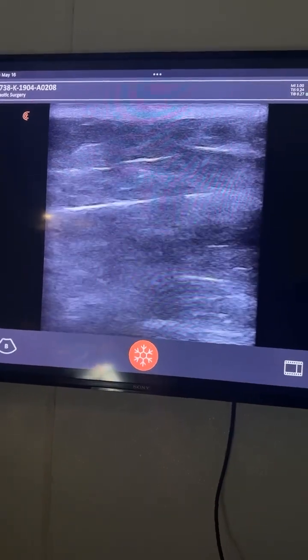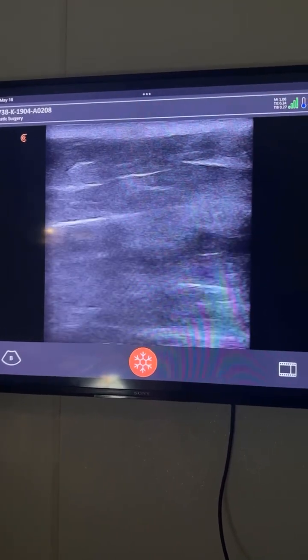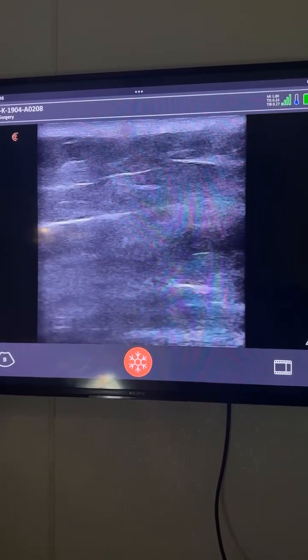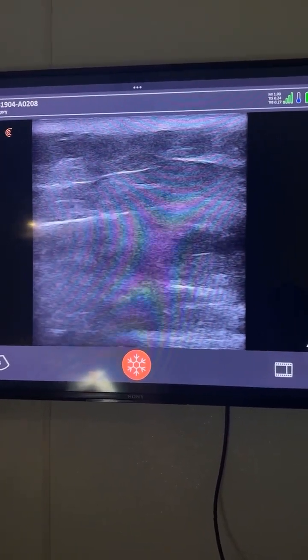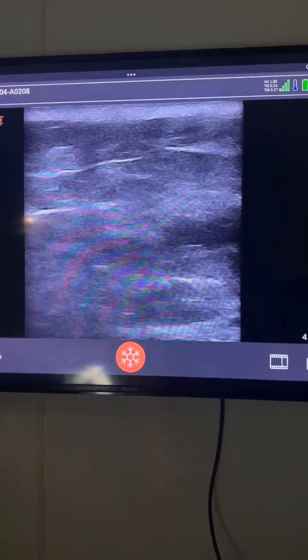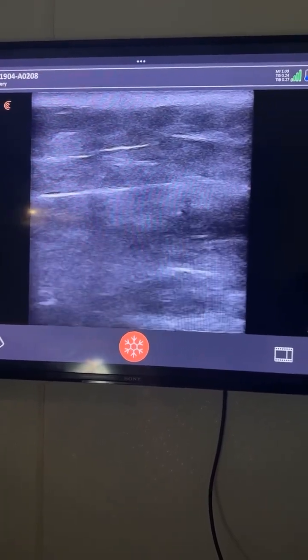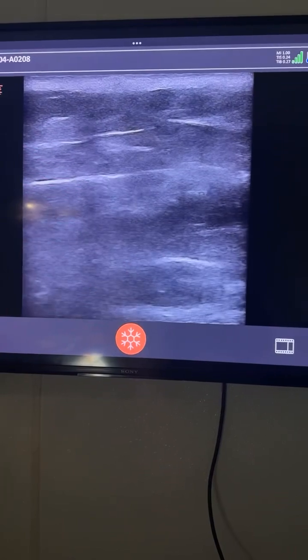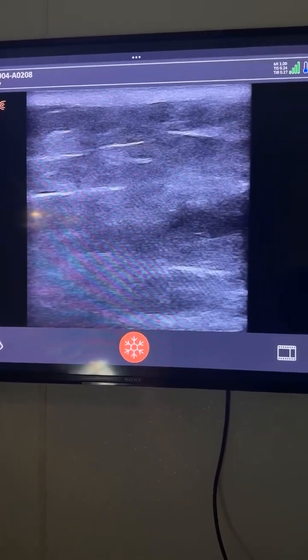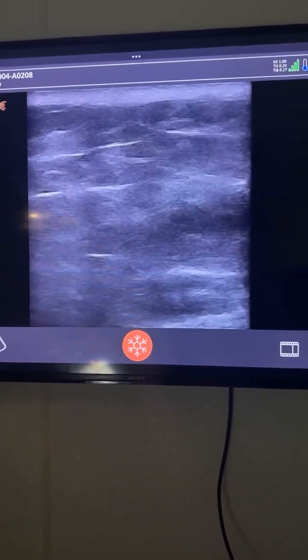And that's where we don't want to put the fat, because the fat can go into the superior or inferior gluteal vein and get absorbed into the systemic circulation, and could be fatal. Thanks to God, we never had anybody die. We want to keep it that way, but this is the safest way to do it, under ultrasound instead of blind, because in a blind procedure, no matter how much experience the doctor has, either intentionally or accidentally, they can put the fat into the wrong place.